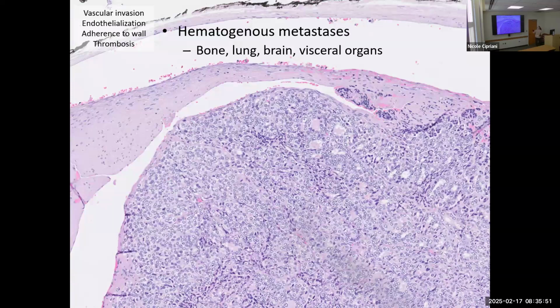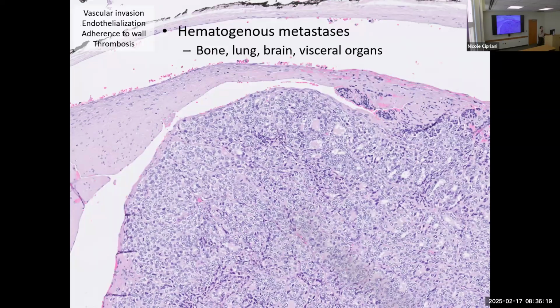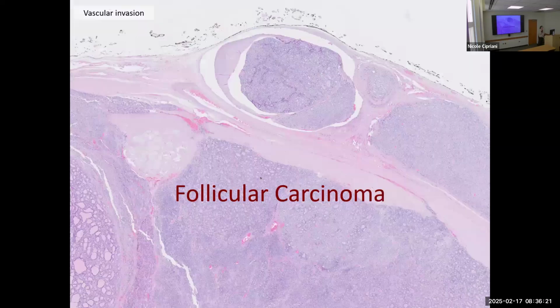And so when you have true angioinvasion, this means that these things can travel to visceral sites like bone, lung, liver, brain, right? As opposed to lymphatic invasion, which is generally small, and generally these things are going to lymph nodes, okay? So angioinvasion is highly clinically significant, but we don't want to over-interpret angioinvasion in tiny little lymphatic vessels, for example. Okay, so that's diagnosis of follicular carcinoma.